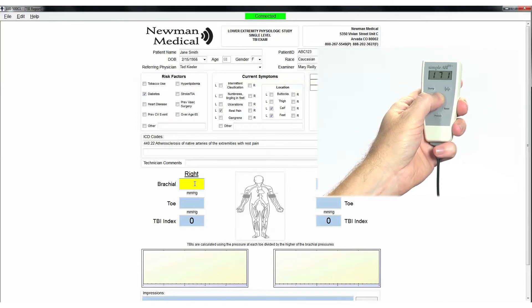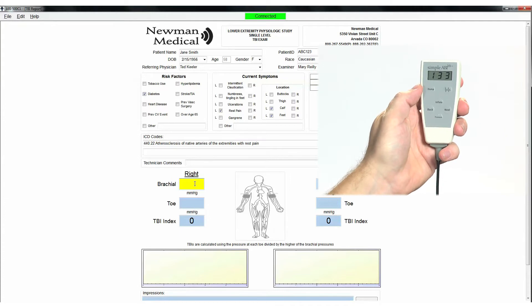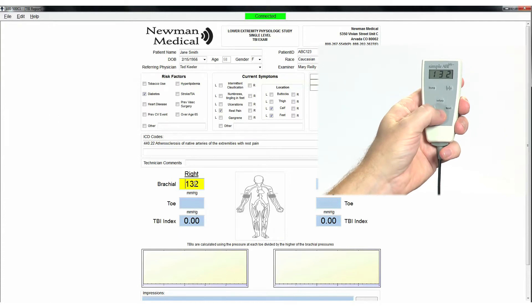Release the Inflate button and the cuff will automatically start to slowly deflate. When you hear the Doppler signal return, press the Pressure button and the pressure will be stored in the right brachial field. If you want to repeat the pressure, just repeat the process and the new pressure will replace the previous one.